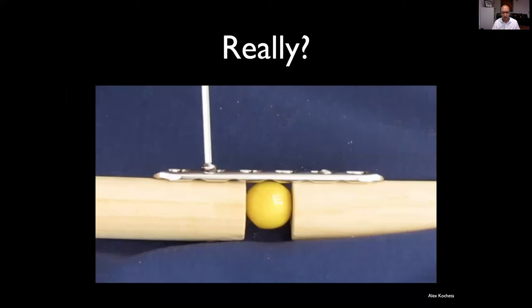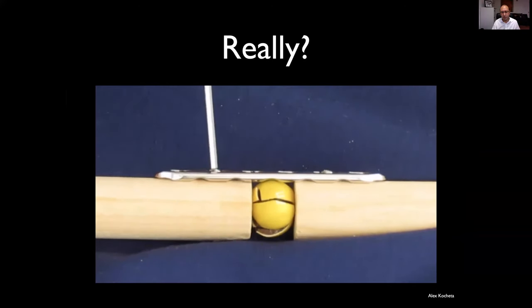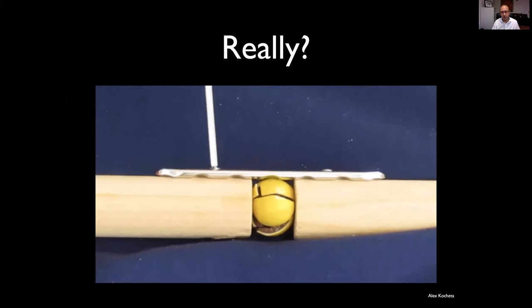Does this really happen? Here's a real 3.5 millimetre DCP plate with a stunt M&M. As I tighten the screw down, the compressive forces are enough to break the candy. The compressive forces generated by a DCP are approximately one quarter of those of an interfragmentary compression screw, but this is the only real effective way to compress a transverse fracture.